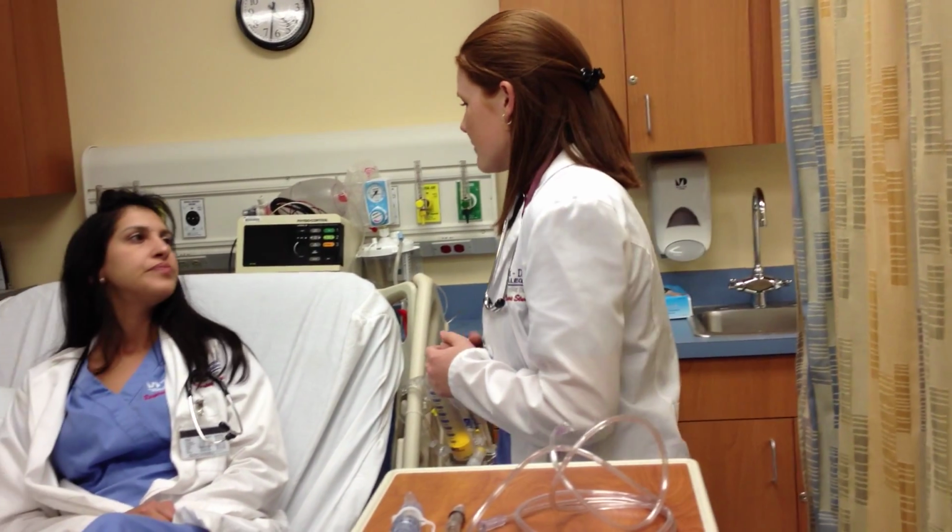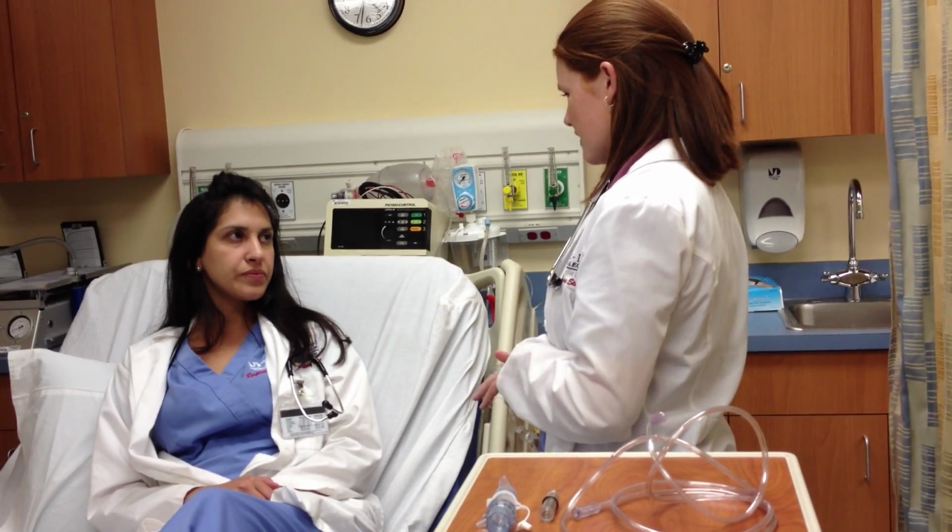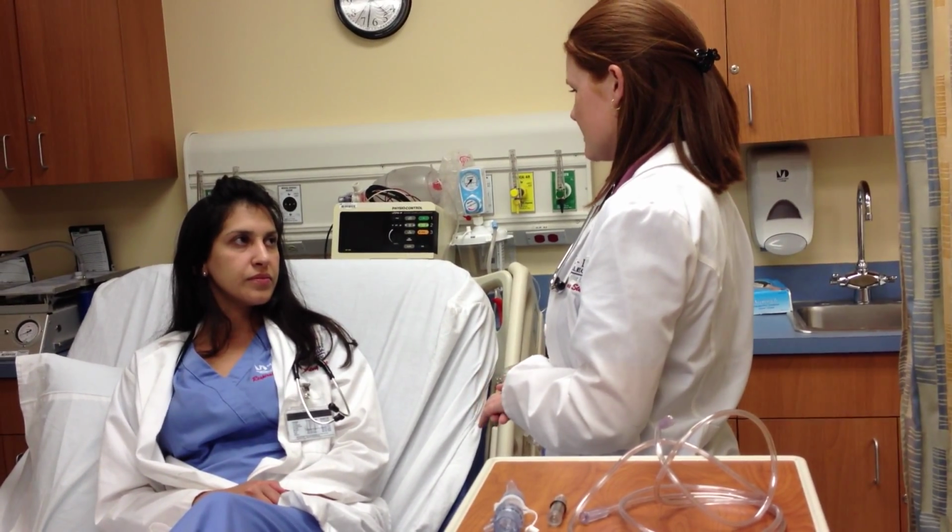You would get your chart, go through your chart to see what procedure you are performing on what patient, and you knock on your door. Hi, my name is Krista. I'm a respiratory therapist for you today. I'm here to give you the Easy PAP treatment.